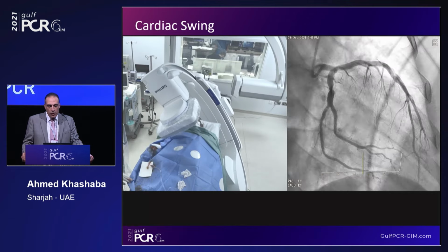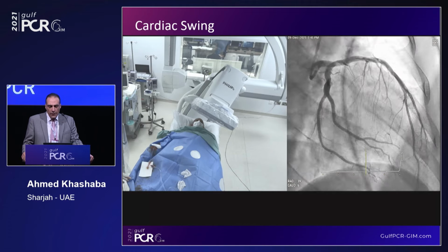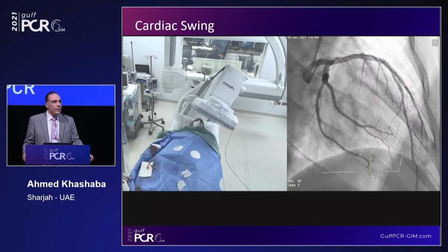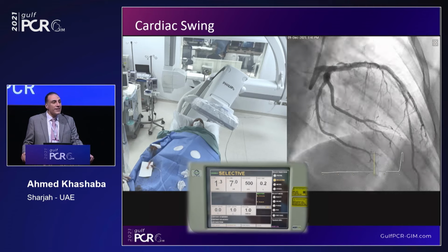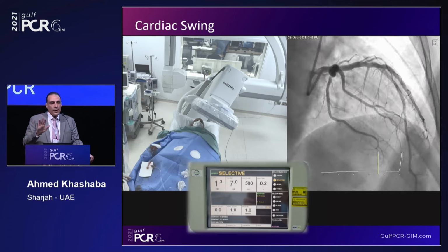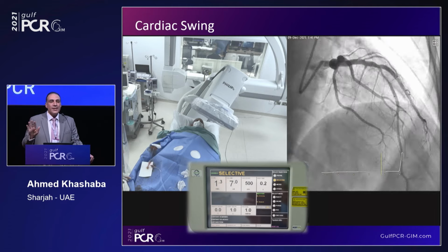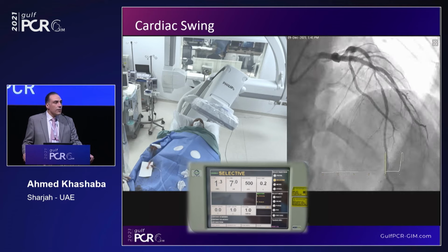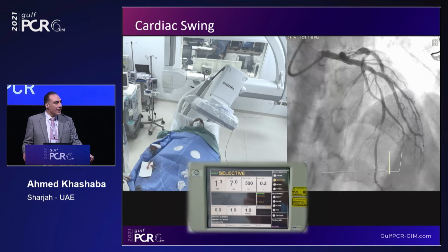This is one example of a patient who presented with a chest pain, positive stress test, and chronic kidney disease stage 3. And we managed to image this left coronary system with only, you can imagine this takes only 7 cc's. The swing in the left system takes 5 seconds. The recommendation by Philips is to do it by 12 cc's, but this injection was taken with only 7 cc's. So we reduced the amount to half of the recommendation, and you can get a very clear image of the left system. The right system swing takes 3.7 seconds, so namely 4.